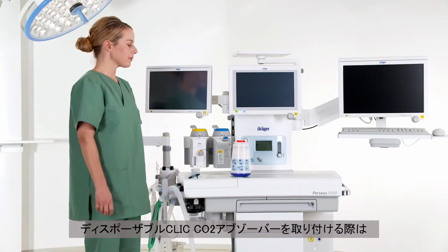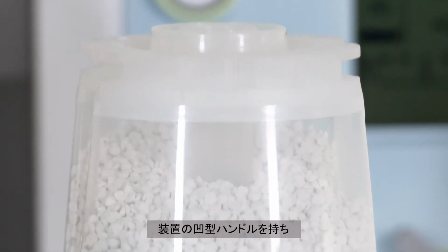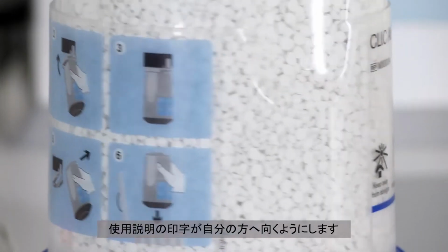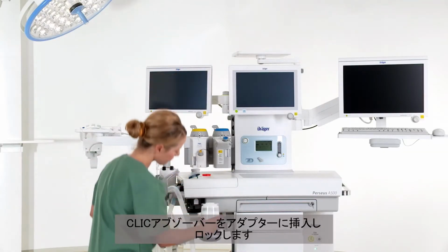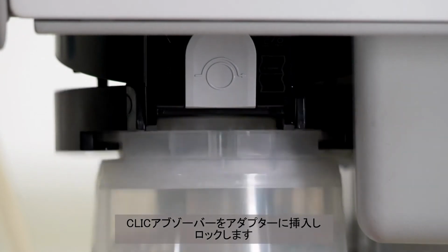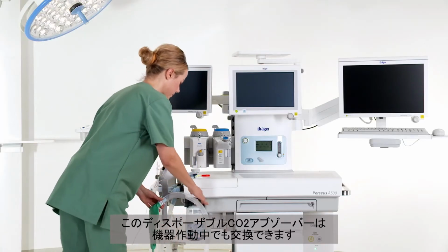Remove the cap of the disposable click CO2 absorber in order to insert it. Hold the device by the recessed handles so that the printed instructions on it are pointing in your direction. Insert the click absorber into the receptacle and lock it. The disposable CO2 absorber can be replaced during the operation.